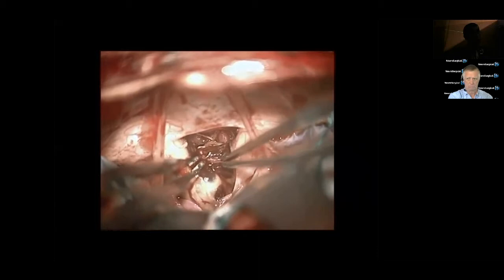So you have to find the plane of the cleavage, and there is usually one. This is a benign tumor, so why not? I'm here cutting in the lesion. I'm not cutting it through the fibers. But this is a decision you have to make.